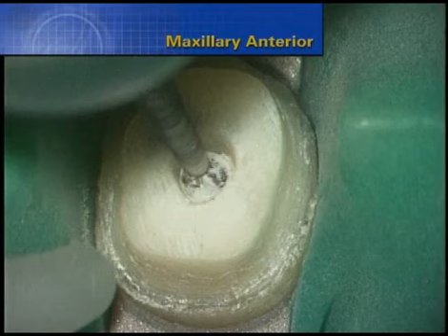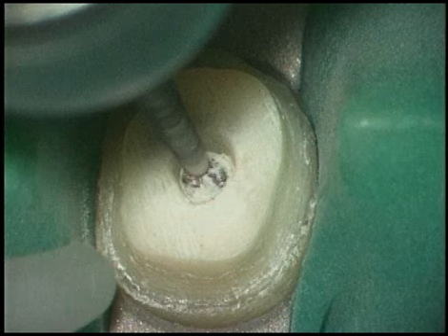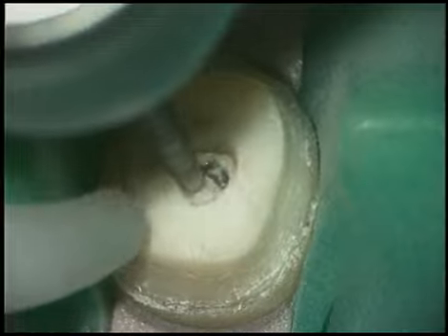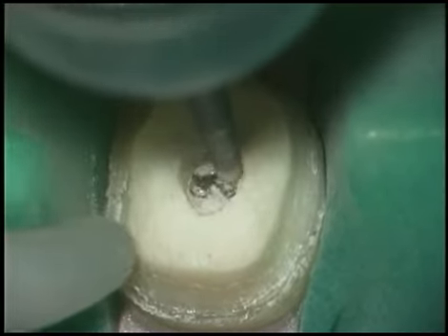It is increasingly common for dentists to encounter broken posts confined within the roots of teeth. Weighing risk versus benefit, we need to remove enough tooth structure to fully expose the post, but yet with an eye towards future restorative procedures. We need to preserve maximum remaining dentin when at all possible.